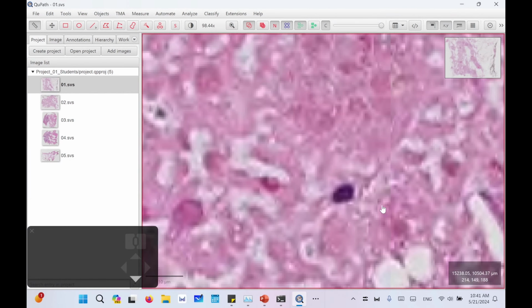By decreasing the minimum, you are getting more contrast, and increasing the maximum, and so on. So by this manipulation, you are getting the nuclei visually here. Or you can press on auto, it will calculate it automatically, as you see here.